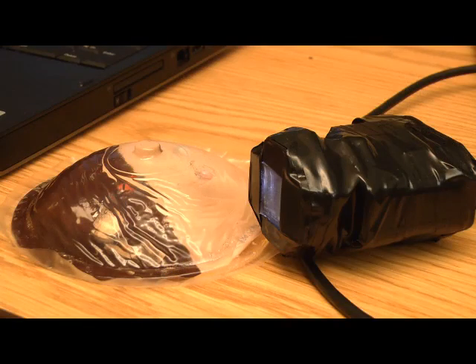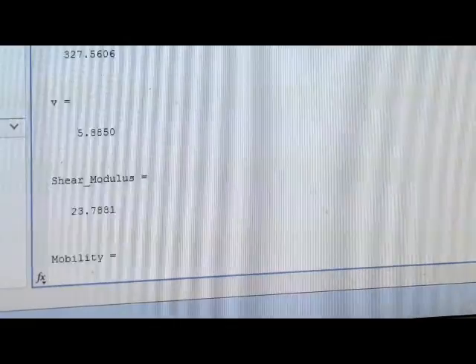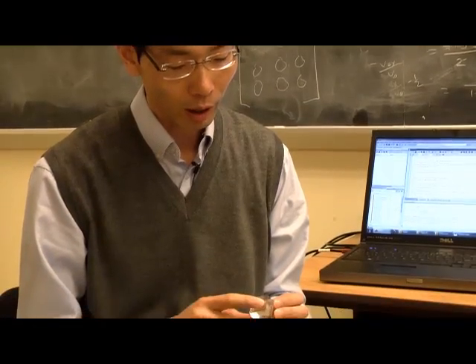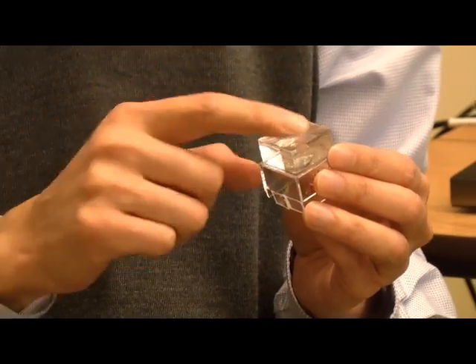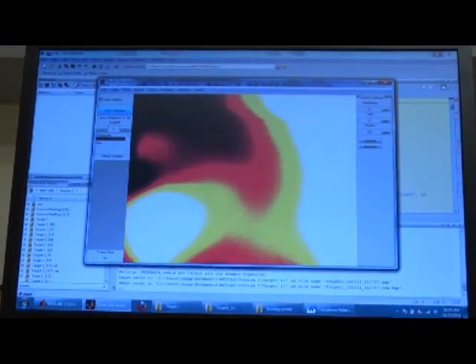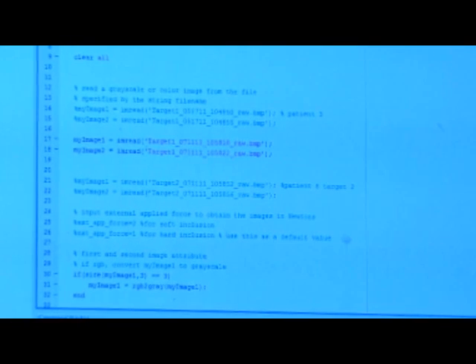A tactile imaging system is a device that we made that can tell the mechanical properties of what it touches. We developed a clear, transparent elastomer, and we inject light into it. As soon as something touches it, whether it's a finger or an inclusion, you can capture this light using a camera, and by processing these images we can actually get the mechanical properties of what is changing the shape of this contour.